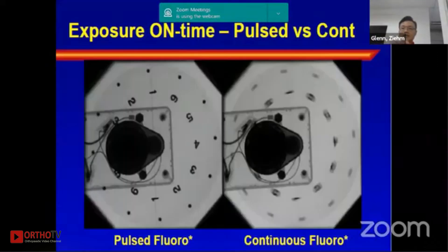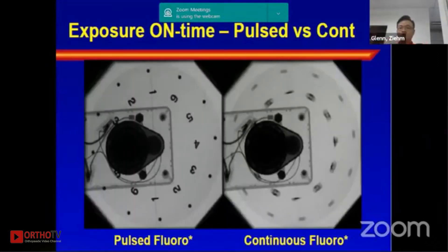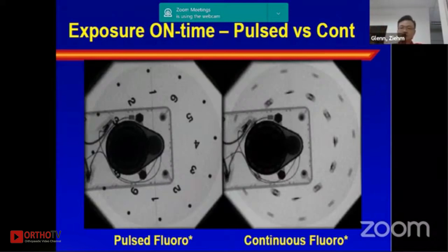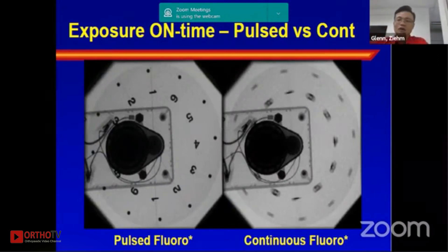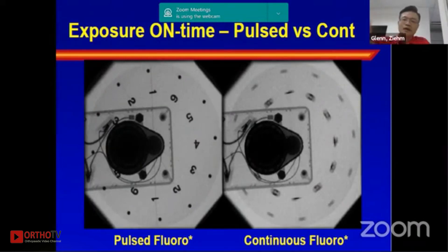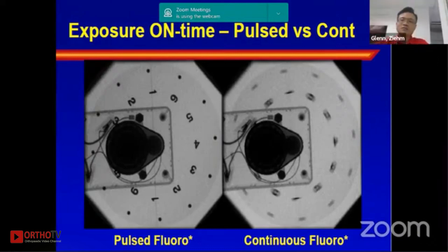During movement in the procedure, as you can see on the right hand side, with continuous fluoroscopy the wording and numbering are blurred, but with pulse fluoroscopy you can still see the numbering clearly.